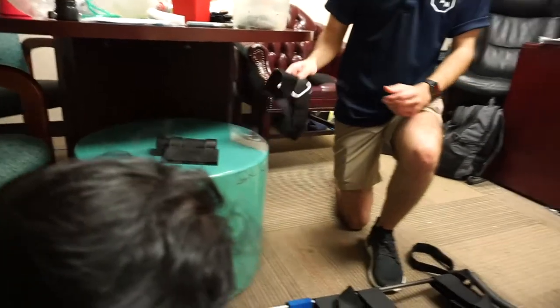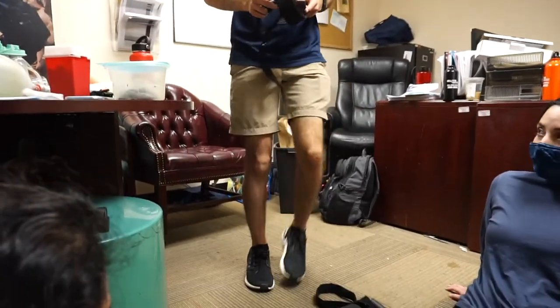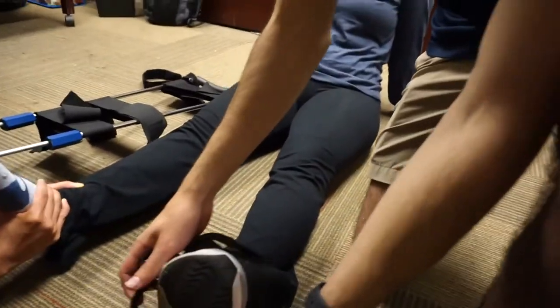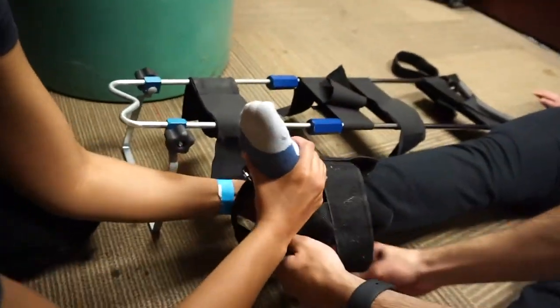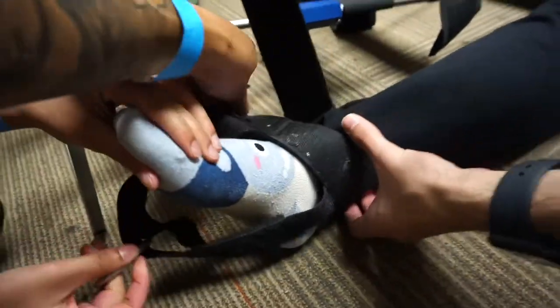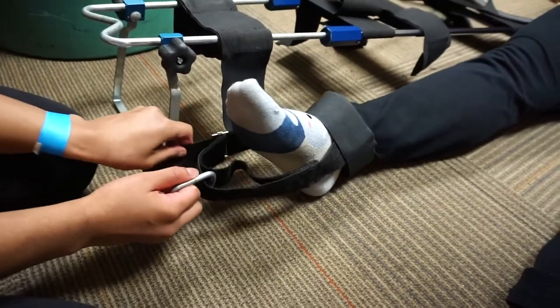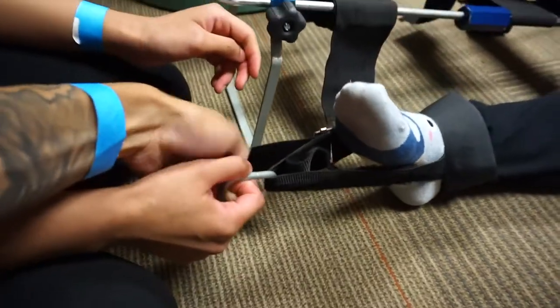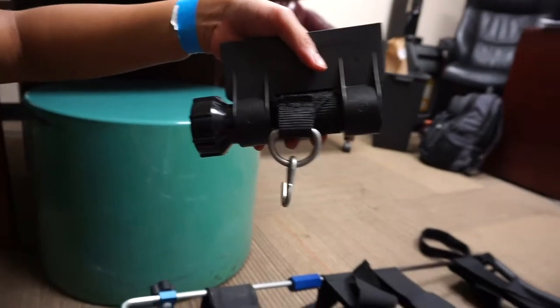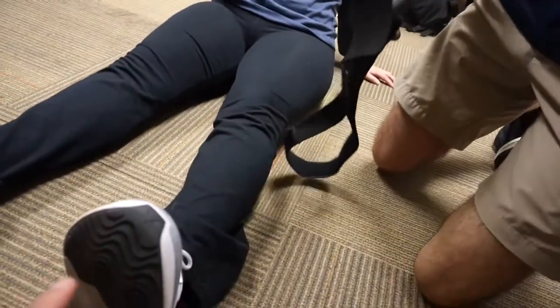Marshall is going to apply what's called an ankle hitch. This looks like a contraption to begin with — go ahead and apply the ankle hitch. You're going to put it over to this one. What's this ring called on the bottom? It's called the D-ring, because it looks like a D. Diane's holding the D-ring, and after that's applied, Diane, you can hold manual traction from the D-ring. This D-ring is eventually going to hook onto the winch using the S-hook over there. Now Marshall's going to take the hare traction splint to the unaffected leg and measure the length we need.